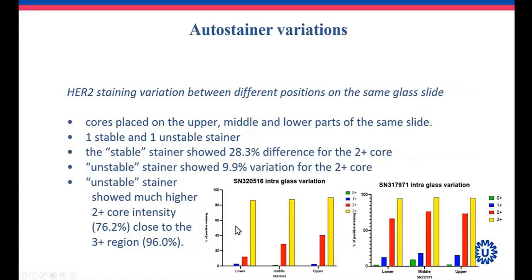Then we tried if there would be a difference if we would position the tissue array core on different positions on the glass slide. So near to the label, in the middle of the slide, and at the end of the slide. We again took one stable and one unstable stainer, and the previously stable stainer showed now quite some differences for the 2+ core, up to 30%, and the unstable stainer showed less variation for the 2+ core. So that was a bit surprising. And the unstable stainer showed much higher 2+ core intensity that was actually close to the 3+ region.